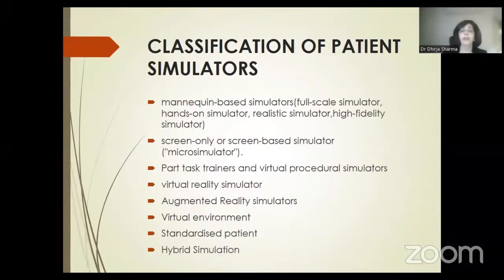For example, in the UGRA workshop, the ultrasound guided regional anesthesia workshop, you would have normal human beings acting out as patients, and we actually see the human anatomy and learn to simulate giving a block on those patients. And then it can be hybrid simulation, in which we are using both types, maybe different types of simulators sequentially.